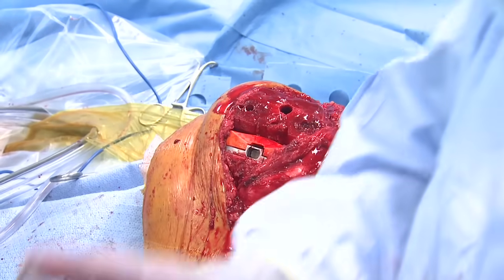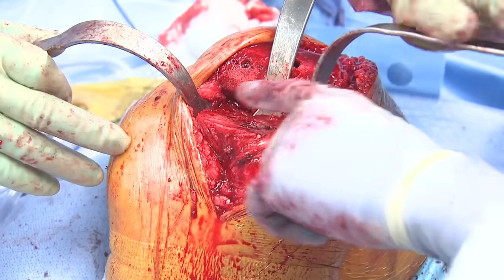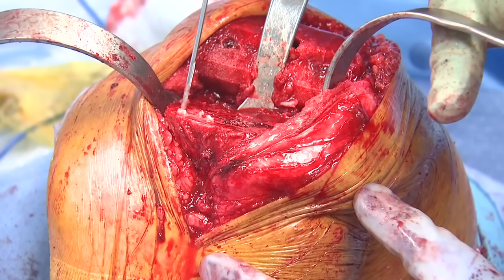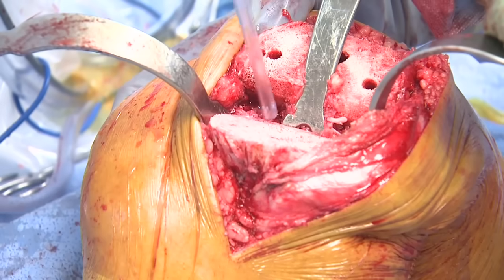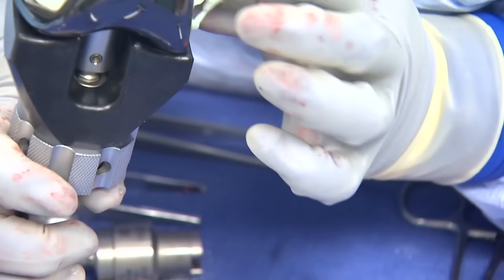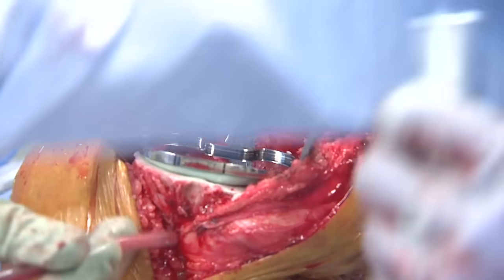All trial implants are removed at this point and both the femur and tibia are prepared for final implants. A drill bit is utilized to provide peg holes for advanced interdigitation of cement with the tibia. Final implants are prepared with coatings of cement by the assistant on the back table. An additional layer of cement is also applied by the surgeon. Implants are then placed and securely seated into final position.